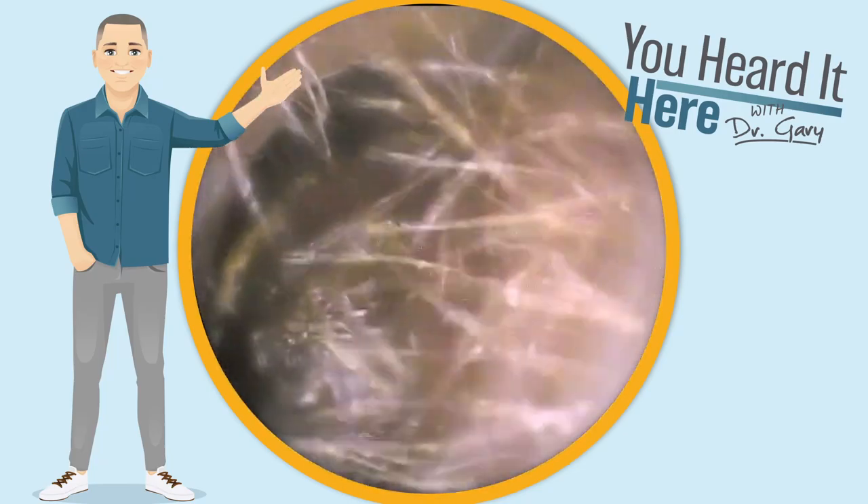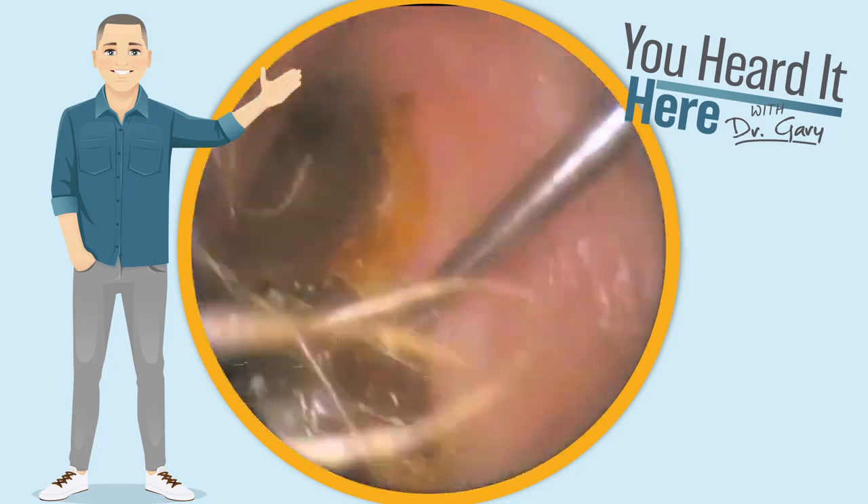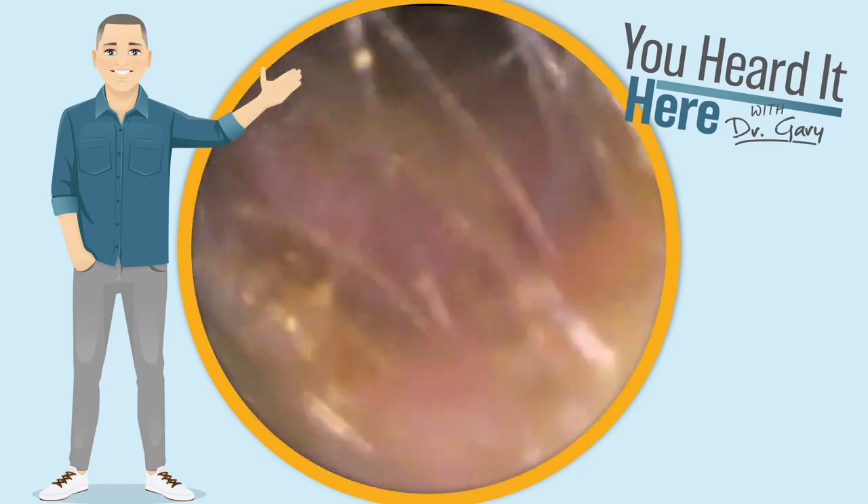Wax comes in all sorts of colors, consistencies, and textures. Our first patient has wax that's very tacky and does a great job at staying together.